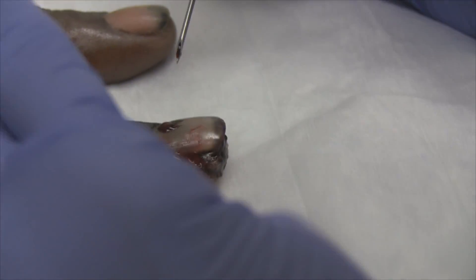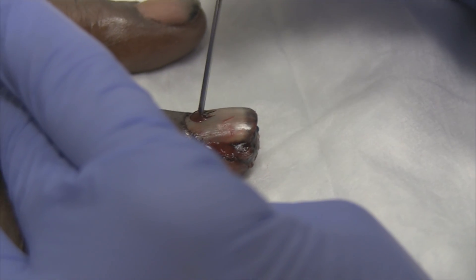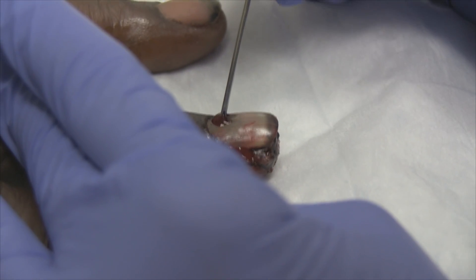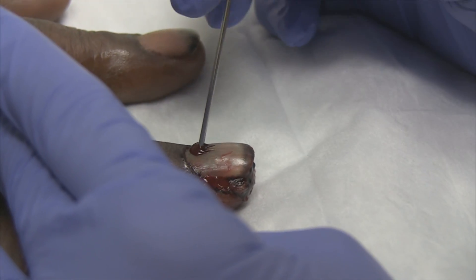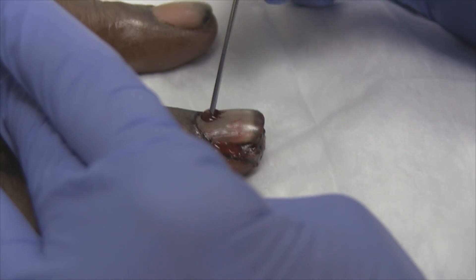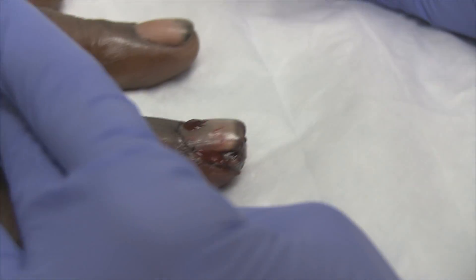This will help relieve some of your pressure in that finger when the numbing medicine goes away. Make that hole big enough because they clot off pretty easily — try and give yourself a little bigger circumference there. We're giving you some antibiotics since this is essentially an open fracture. We'll keep doing it until we give ourselves a big enough hole so it'll continue draining.